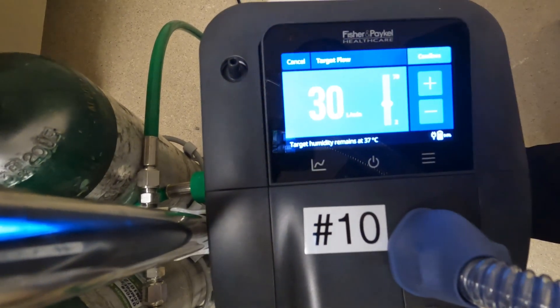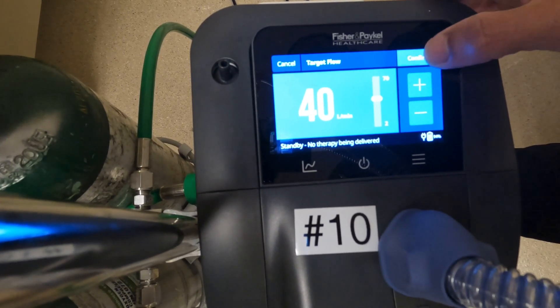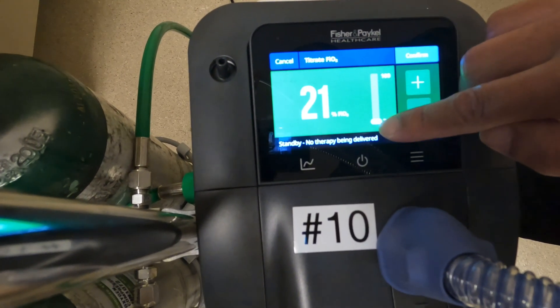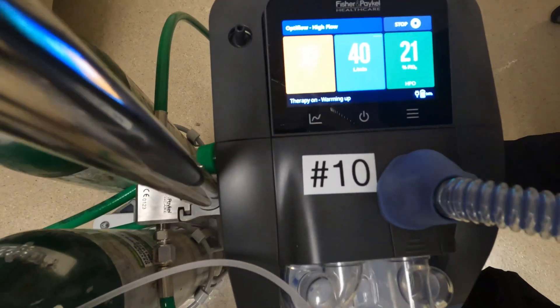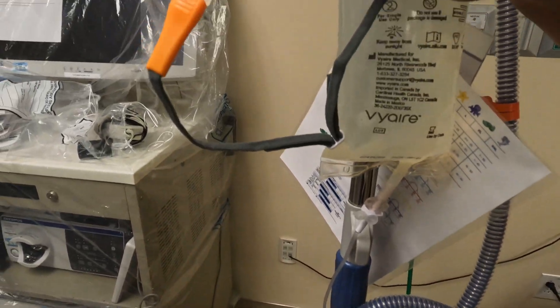For flow, we'll start at 40. Confirm. And then oxygen — you can slide it to whatever level, but today we'll keep it at 21%. Confirm. So now we'll start it up. Now you can hear the oxygen going through and the flow.